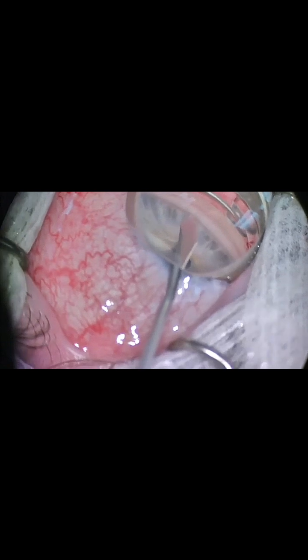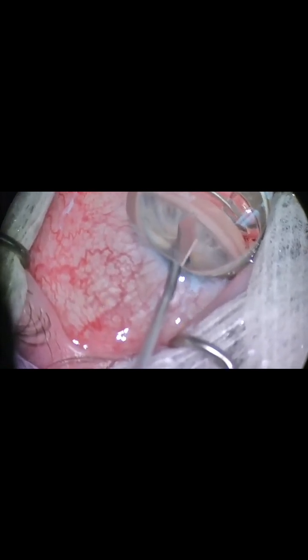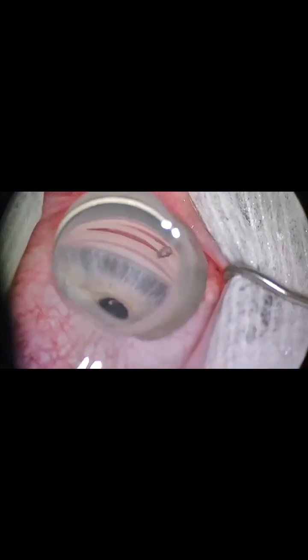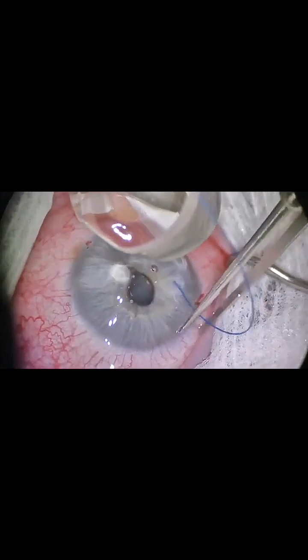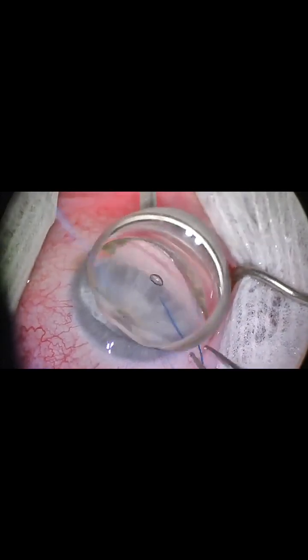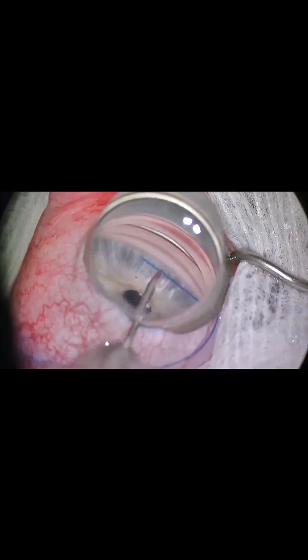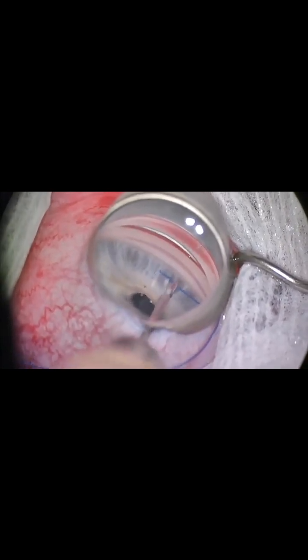Next is inserting the suture inside the anterior chamber and then cannulating Schlemm's canal. To insert the suture inside Schlemm's canal and cannulate that canal all the way around the anterior chamber, a microforceps is used, and the suture is pushed inside Schlemm's canal.